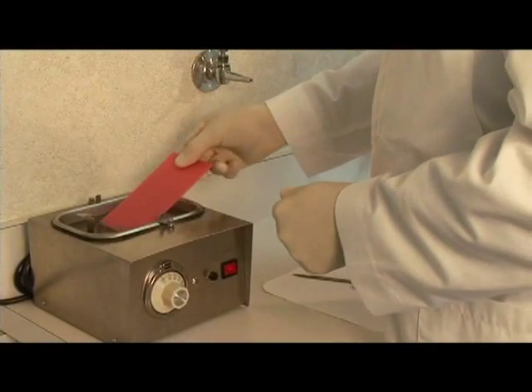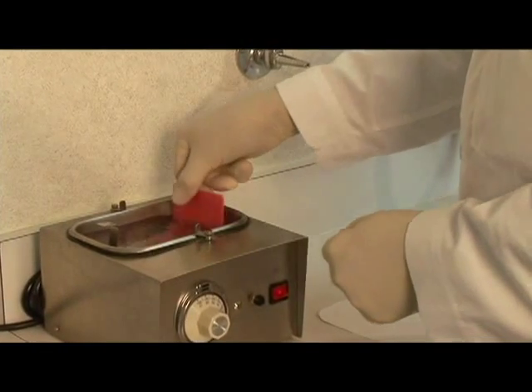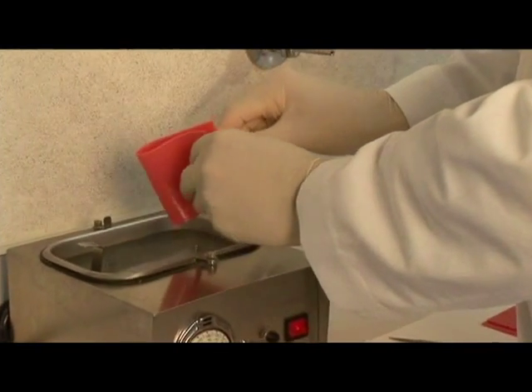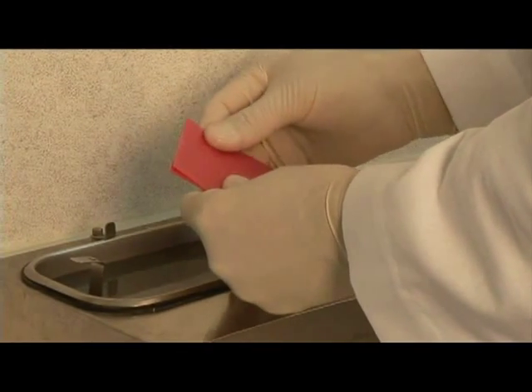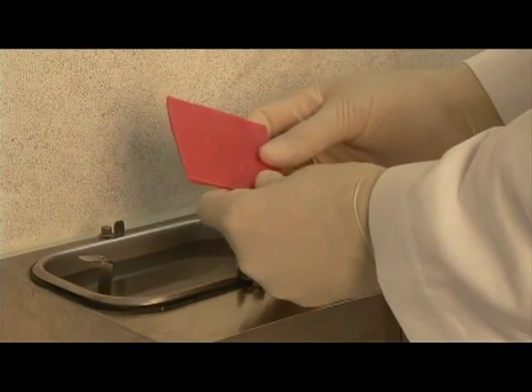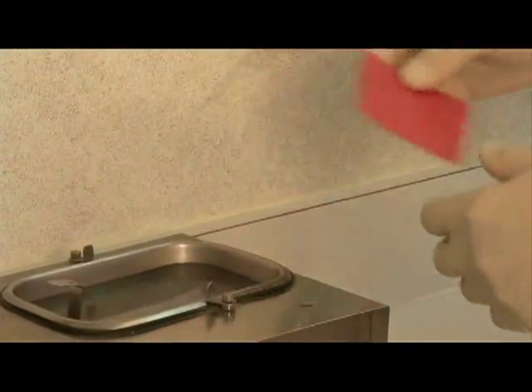All right, we're going to prepare the interocclusal recording material. What we use for this particular step is Beauty Pink Extra Hard Wax made by Moyco. This is tempered in a hot water bath preset at 140 degrees.